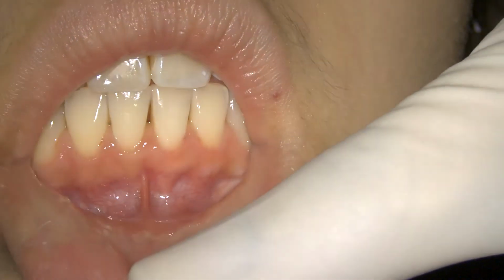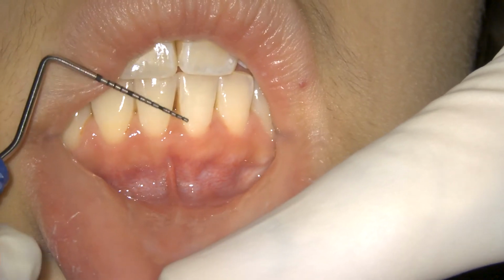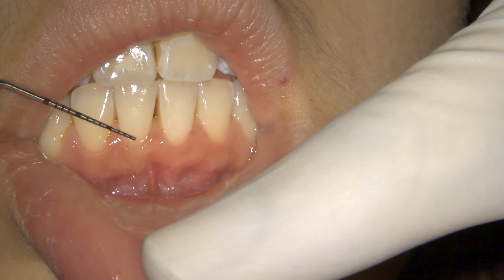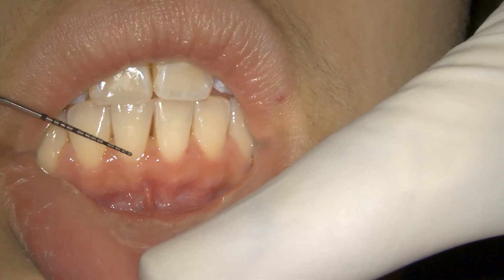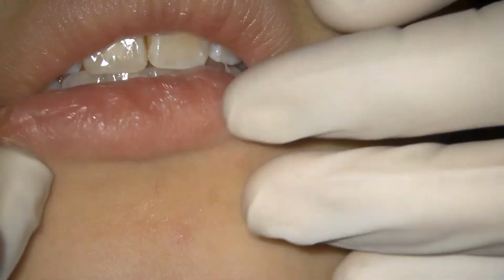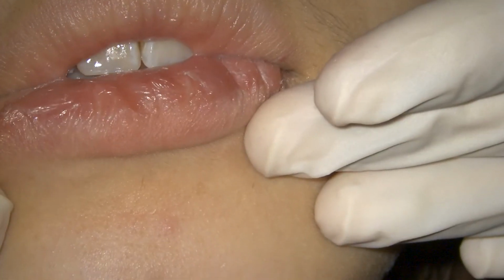So as you move the lip, the sulcus can be opened up, and this can also lead to pocket formation, gingival recession, and many other gingival inflammatory signs. So it is very, very important to assess the amount of attached gingiva in a patient.